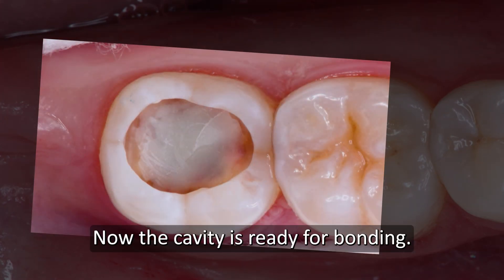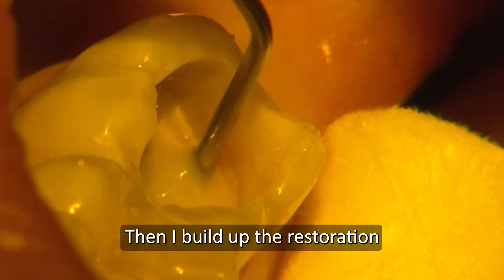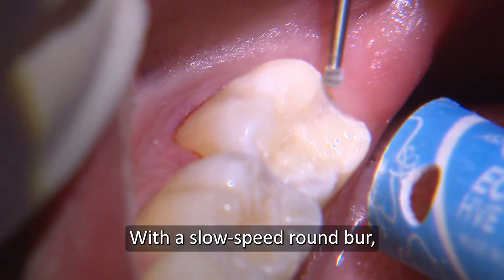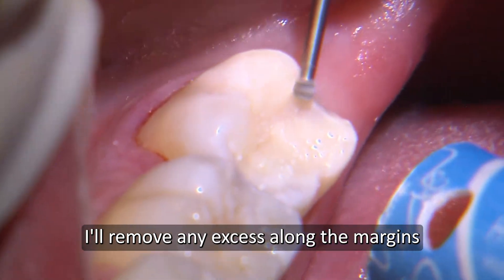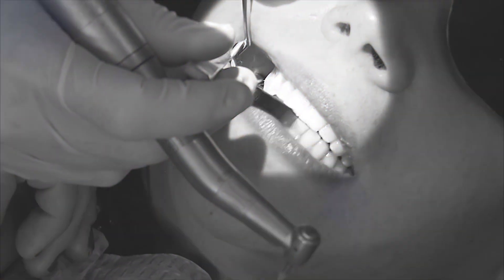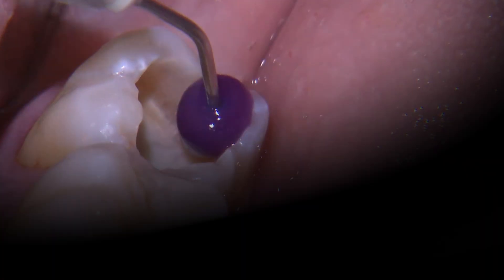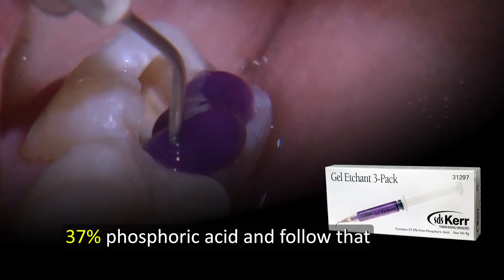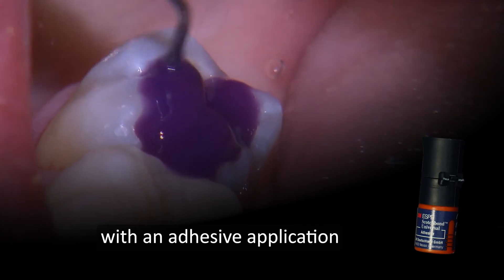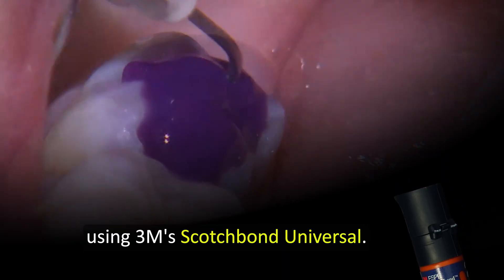Now the cavity is ready for bonding. We etch with Kerr's 37% Phosphoric Acid and follow that with an adhesive application using 3M's Scotch Bond Universal.